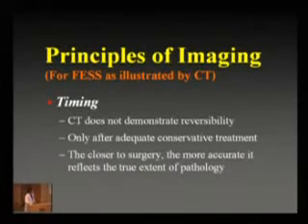Because otherwise, a lot of this potentially reversible element will be picked up by the CT scan, and by the time you operate on the patient, it may not be there. And the second thing concerning timing is when you have ordered a CT, if it is a few months before your surgery, by the time you operate on the patient, the condition may have changed. It can get worse and it can be better. That's why the closer to the time of surgery, the better the pathology picked up by the CT will be reflected in the actual situation.